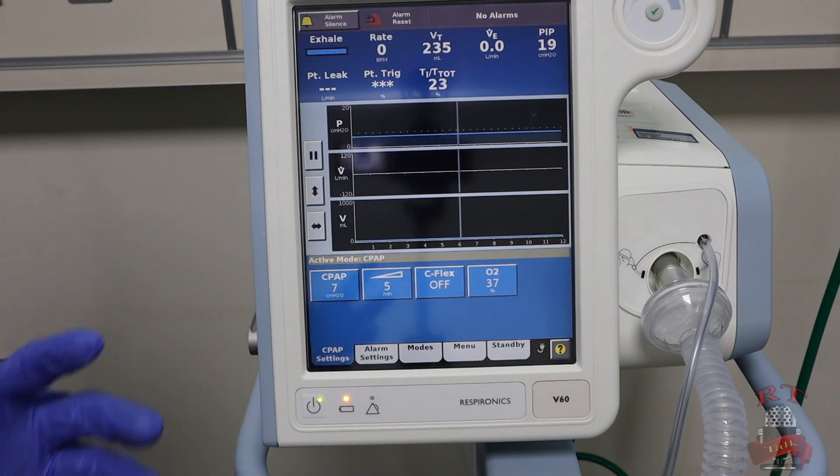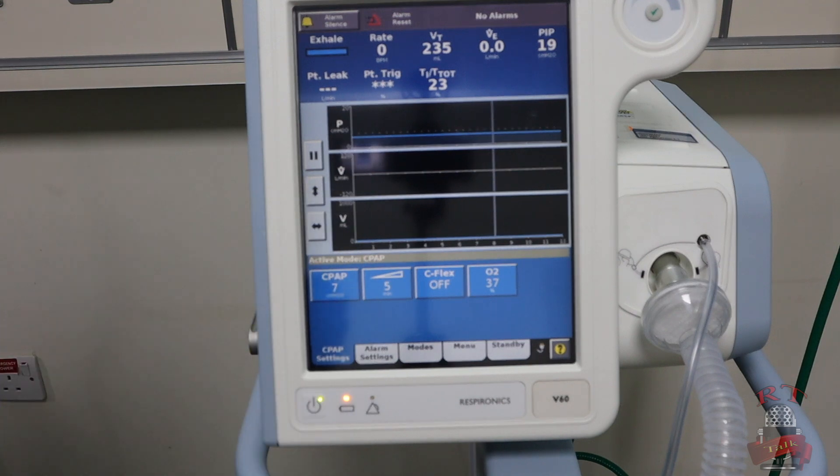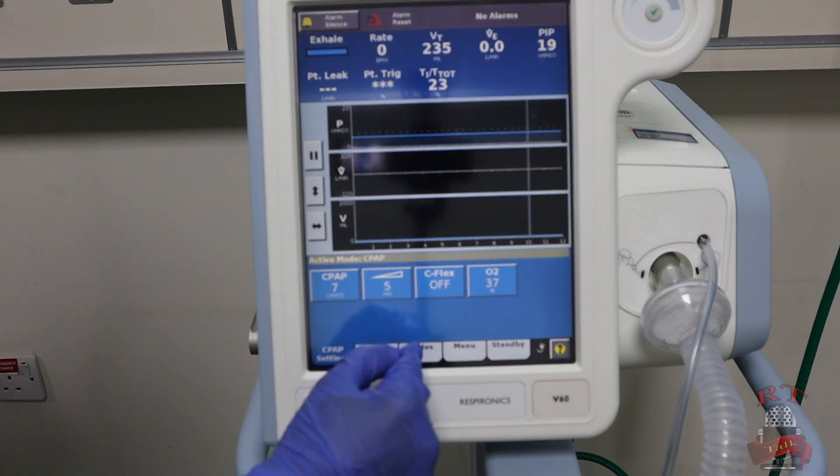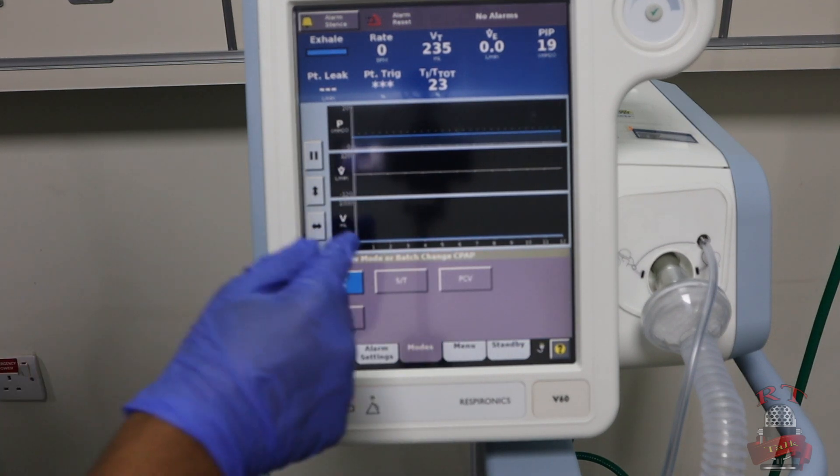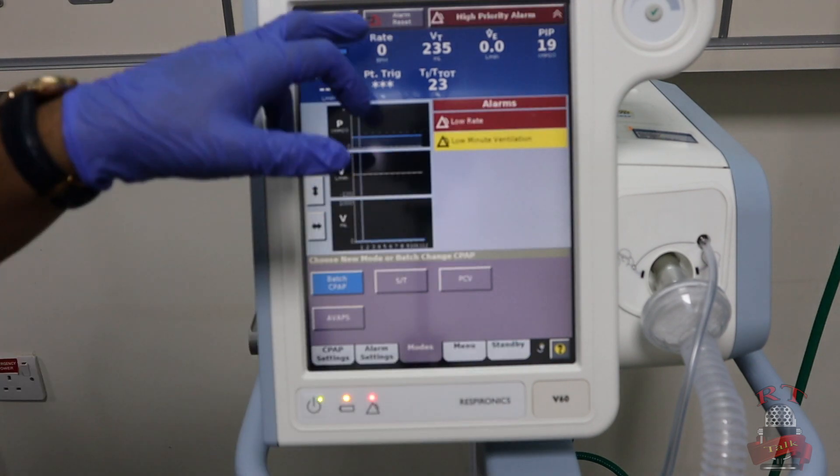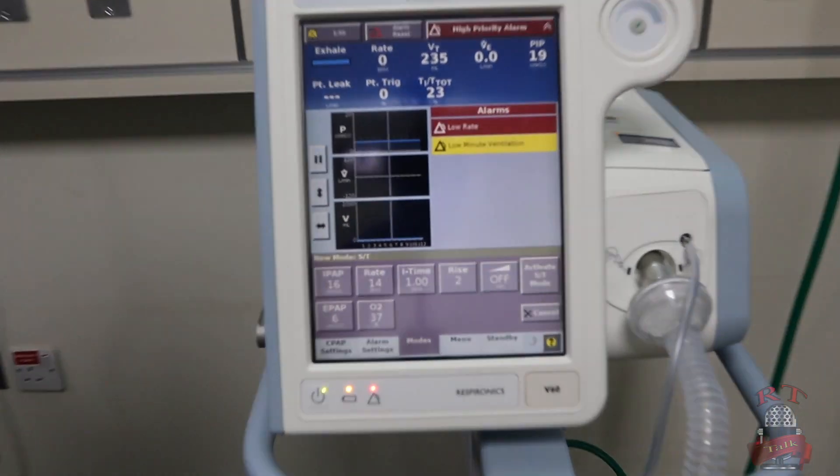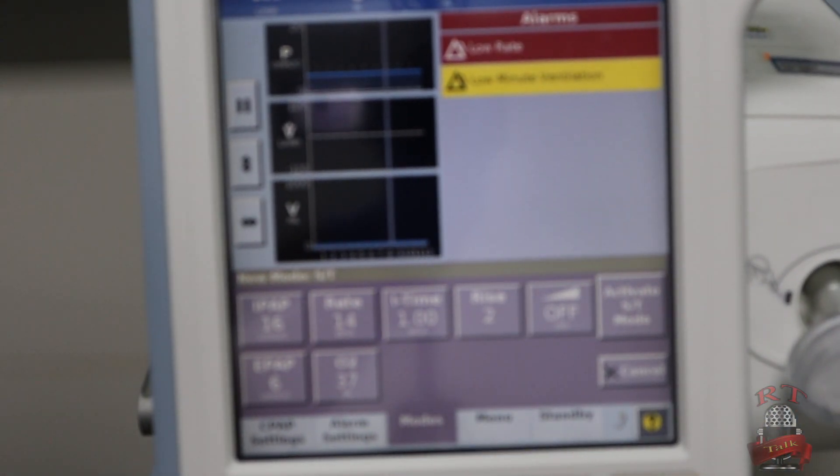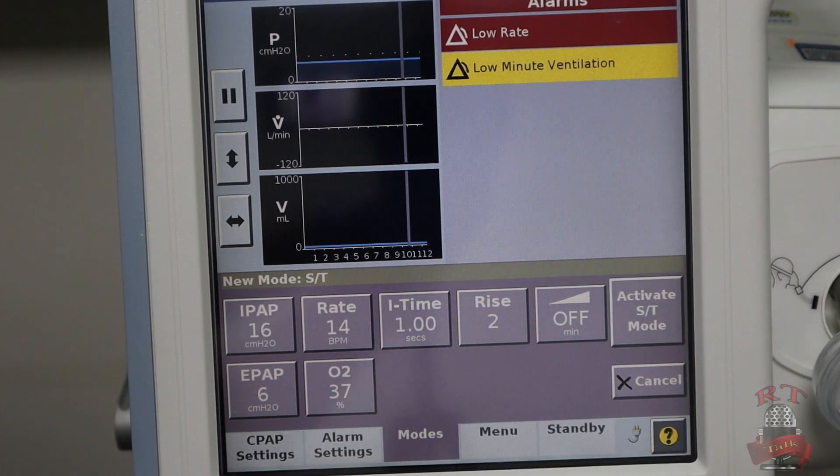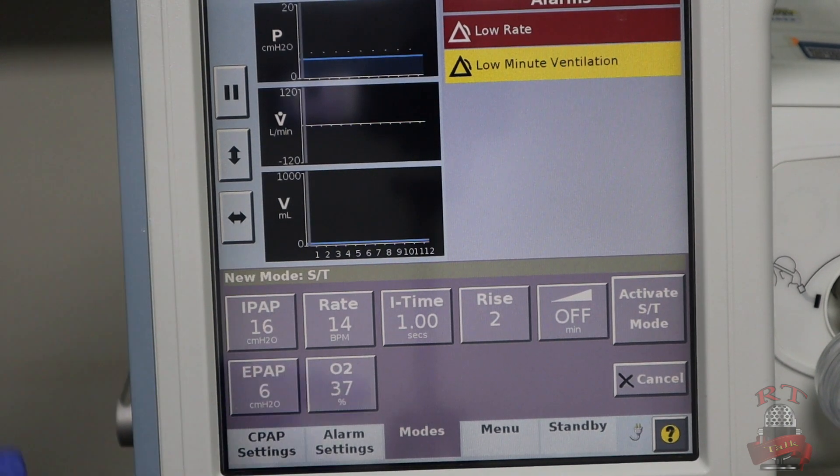Now, your patient needs BiPAP. So you will go to choose mode again. Then you will go to ST, which is spontaneous time, and you will start to set your mode. I will also make it a little bit closer so you can see the picture.